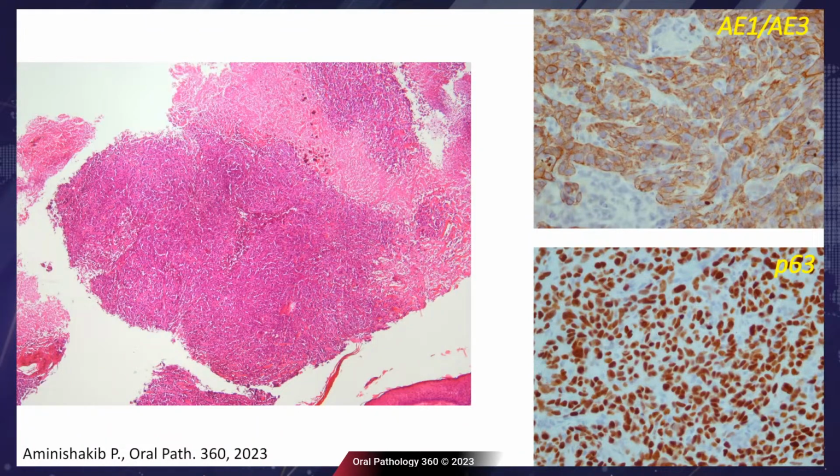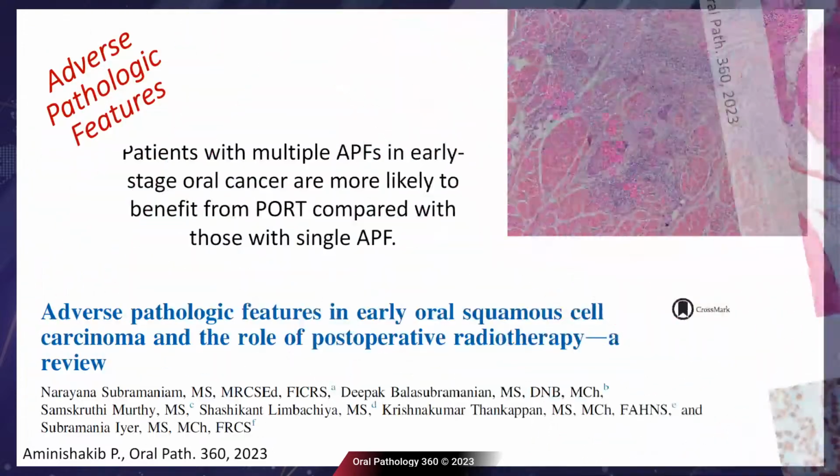When you have a poorly differentiated squamous cell carcinoma, you need an IHC study to determine if the origin of the tumoral cells is epithelium or not. And you can use pancytokeratin and P63 to determine if the undifferentiated tumoral cells originate from epithelium or not.